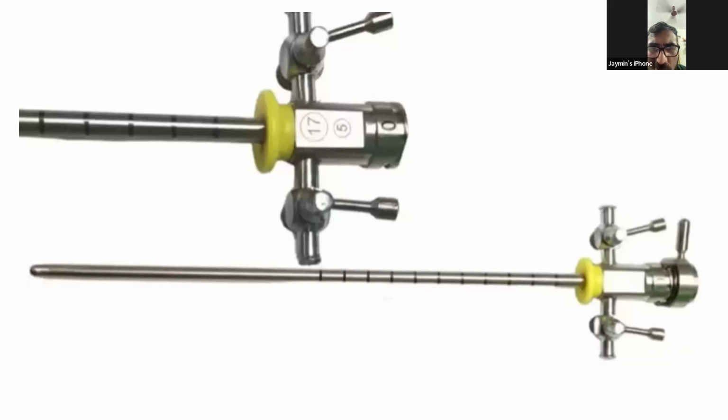It is the outer circumference of the sheath, 17 French. 5 indicates that only a single channel bridge could be attached to the sheath, which will accommodate a maximum size of 5 French ureteric catheter. And 0 is for the orientation when we connect the bridge to the sheath, sir. So we coincide both the zeros on the sheath and the bridge for proper orientation of connection. Now, why are you saying 5 French ureteric catheter?